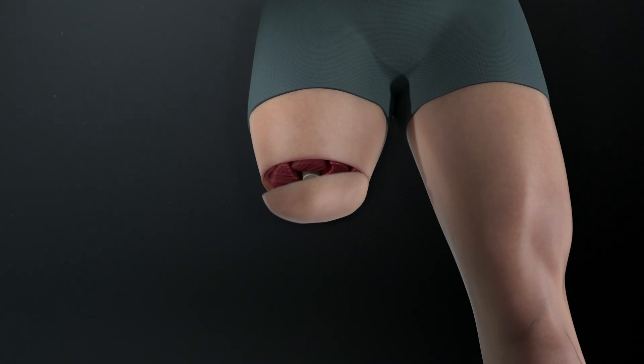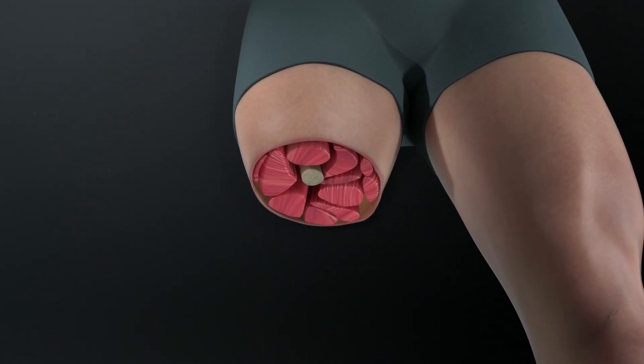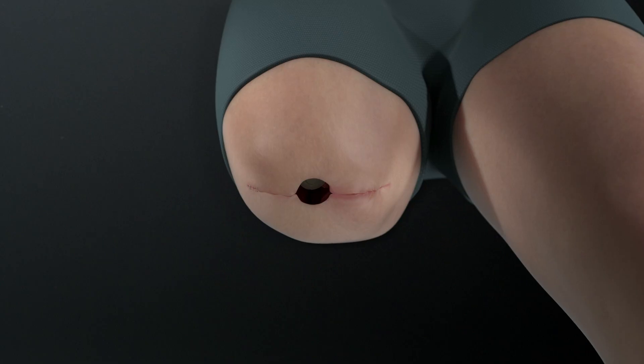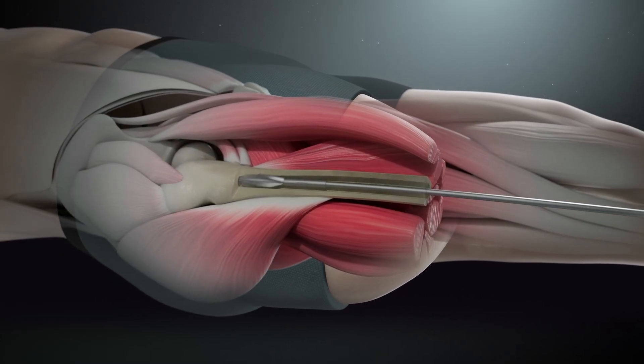Osseointegration is a technology that is utilised as a support for amputees or those living with limb loss. It is a surgical procedure where a titanium implant is inserted into the residual bone. Your bone grows into the implant and integrates with it, and this creates a very strong and secure connection.